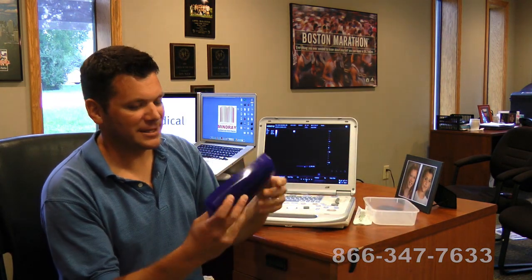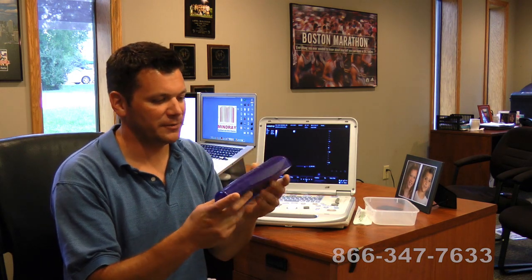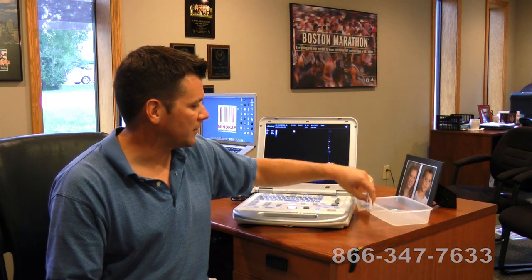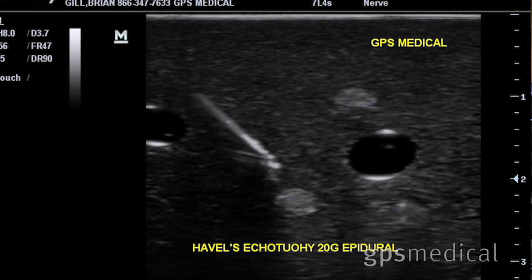Some would say the image quality is better than any of the GE Logic E or Logic I products, but with most things, that's pretty subjective. I've also added some images for needle guidance using what we call a phantom — this is called the Blue Phantom. I've been taking images with needles, doing nerve injections, so you can get a good idea of what it's like to do pain management and what kind of images you get with needle guides.